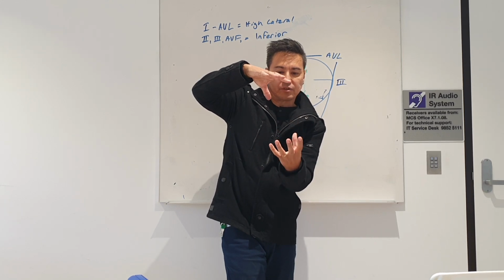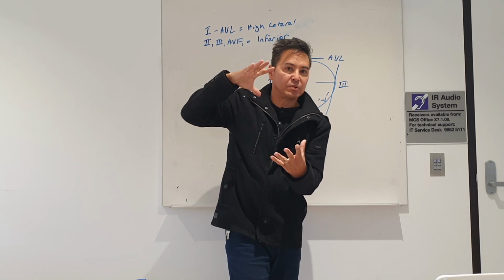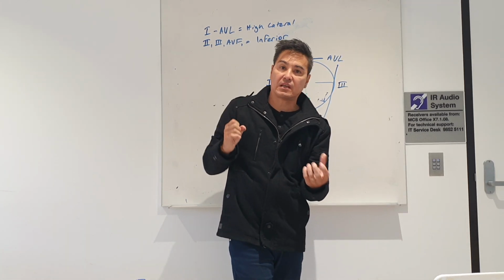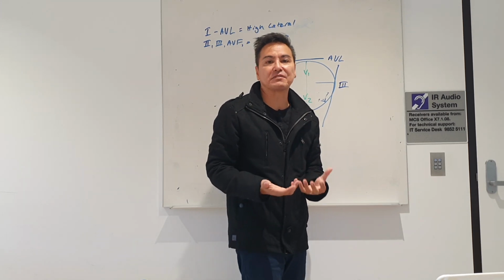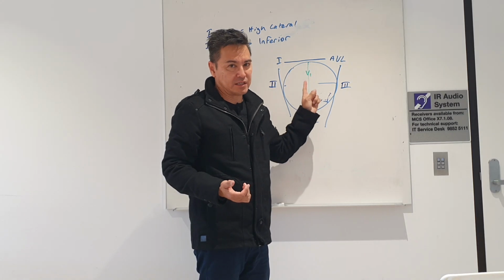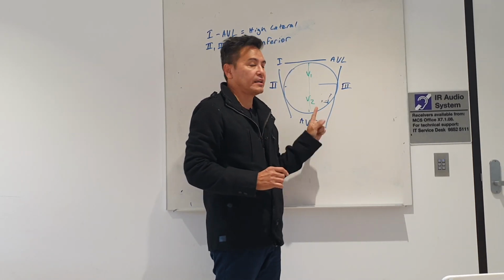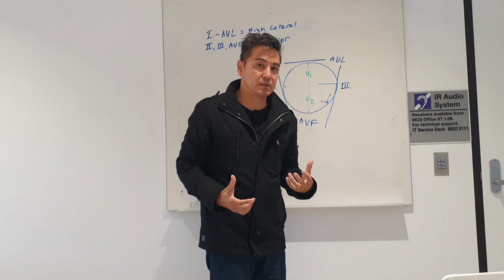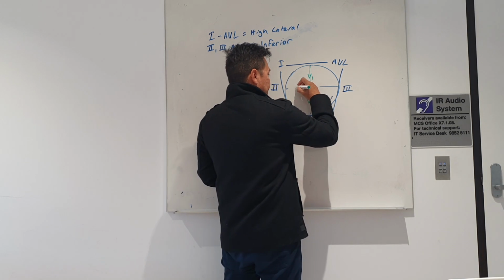So when our left ventricle fills, part of our septum has some elasticity that's going to kind of pull it back into place and give us a bit of an ejection fraction, which is all we're really saying. It's going to give us a systolic blood pressure. So we don't want any damage done to those. Okay, so if I see any of this pathology in these leads, I'm going to start to worry. Okay, and this is really important here.